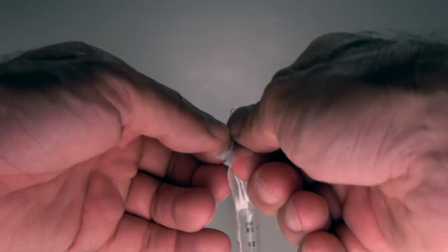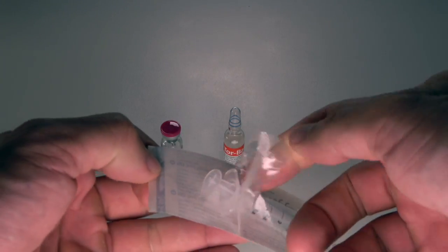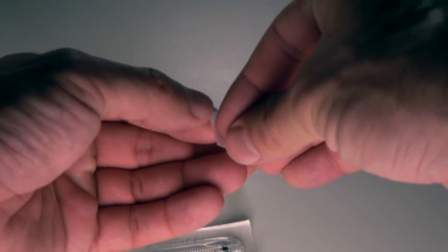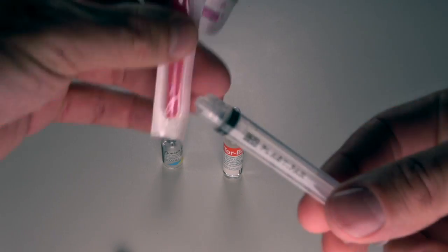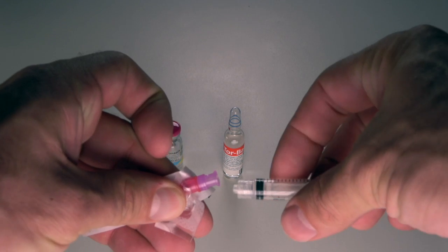Carefully open the syringe packaging, making sure not to touch any part of the Luer-lock syringe. Now open the packaging for the needle filter, being careful not to touch any part of the needle filter. At this point, assemble the syringe by twisting the purple filter needle onto the syringe.